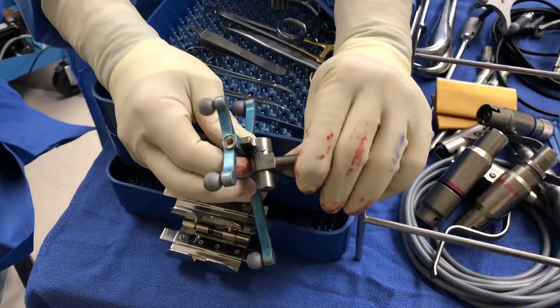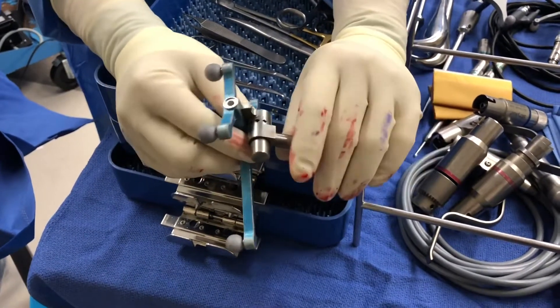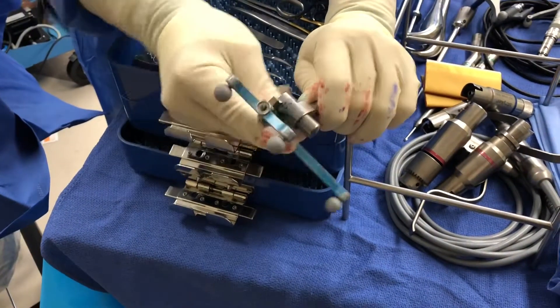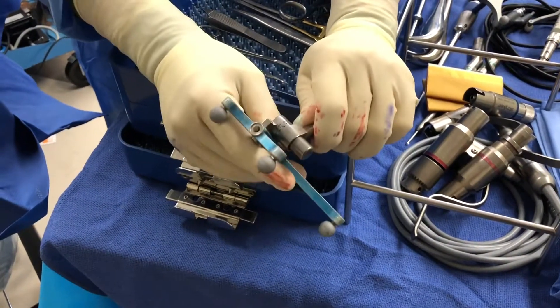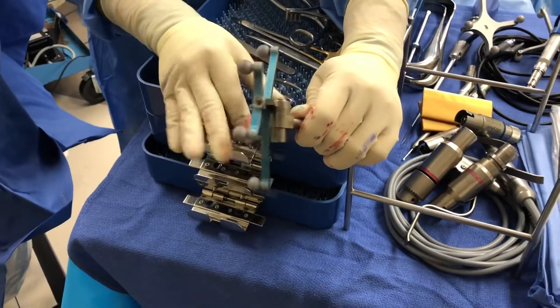Here are the teeth. Here's how they're going to be perched up. So when I put this in, I put a little mark here to make sure that I know it hasn't moved during surgery. I usually worry that it moves like this — from one position to another.